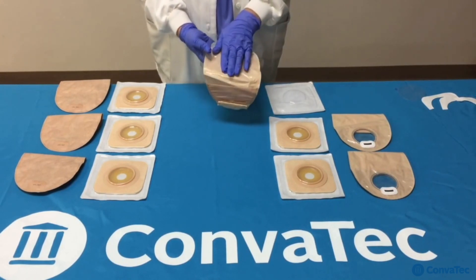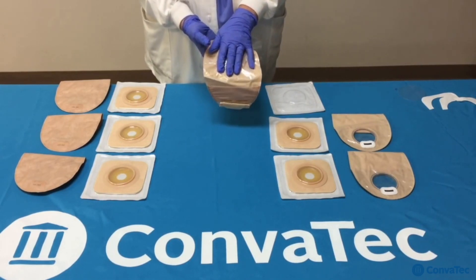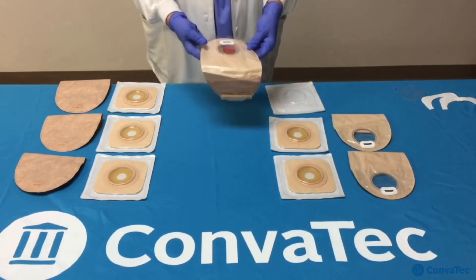You would take your hand and hold it over your stoma, usually for about 30 seconds, maybe up to a minute at most. This allows the adhesive to really adhere and stick to your skin. Always make sure your pouch is closed. And now you're ready to go.